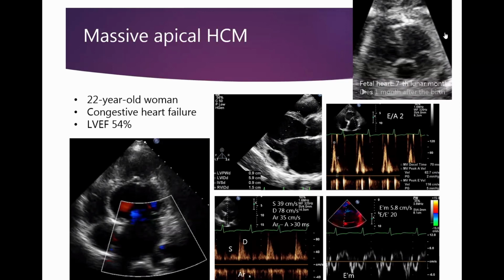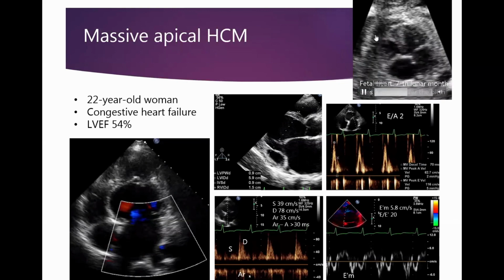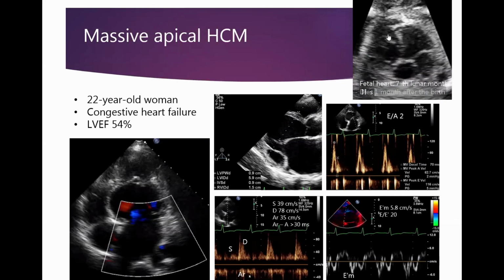On the upper right panel, the fetal heart of her baby in the 7th lunar month is shown, and we may see that there is some thickening in the apex. Unfortunately, the baby dies 1 month after the birth.